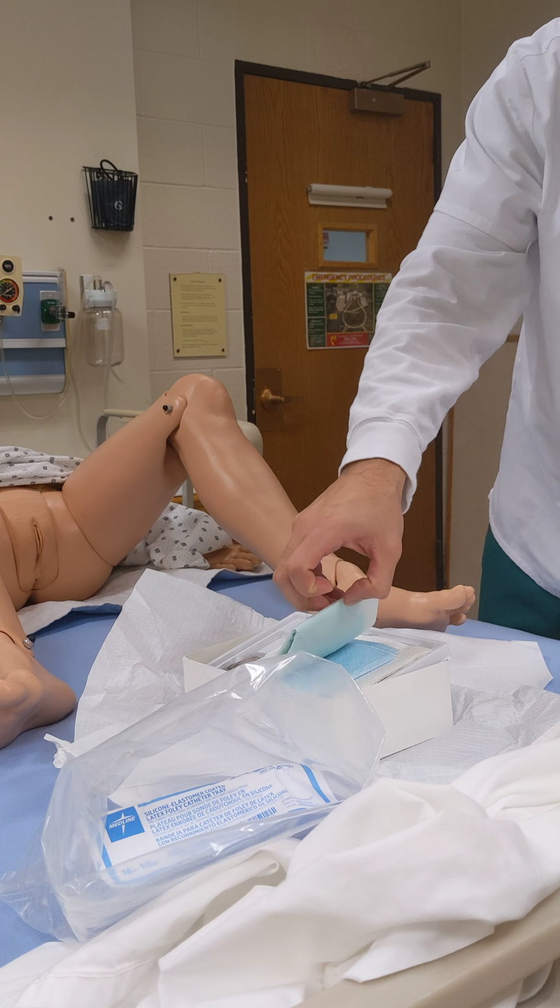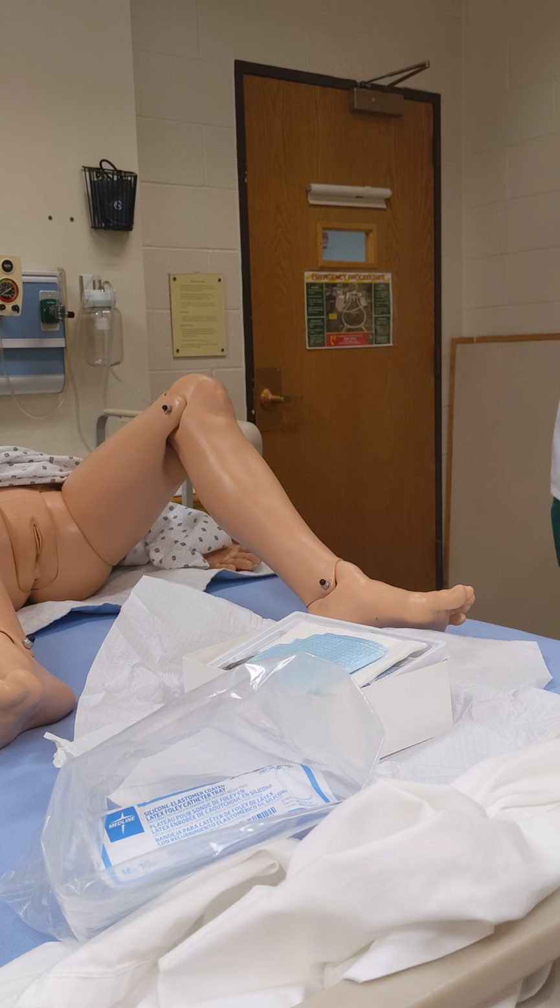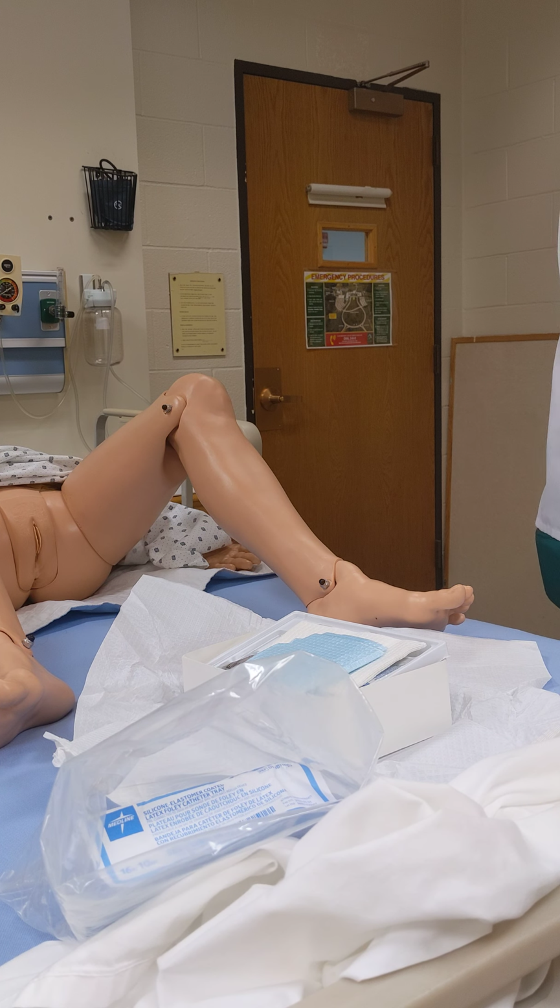I'm going to begin by grabbing the gloves. I'm a lefty, so I'm going to start with my left hand first, and then my right.